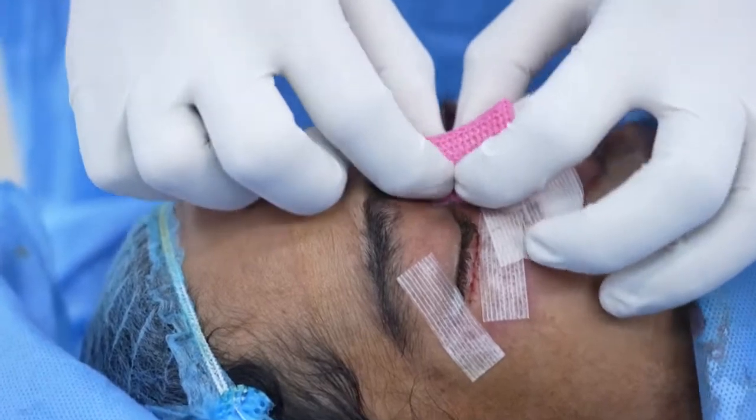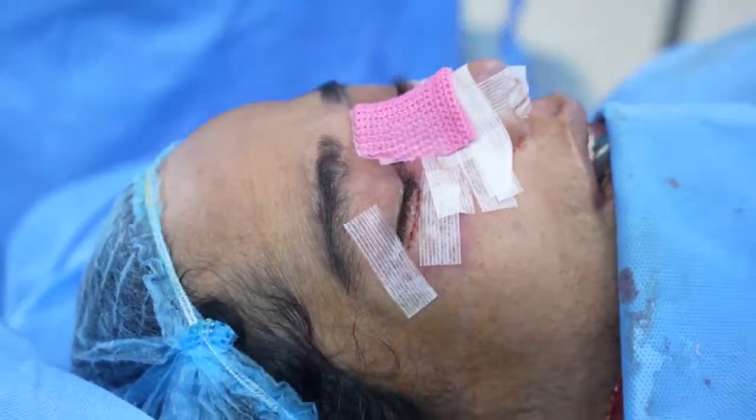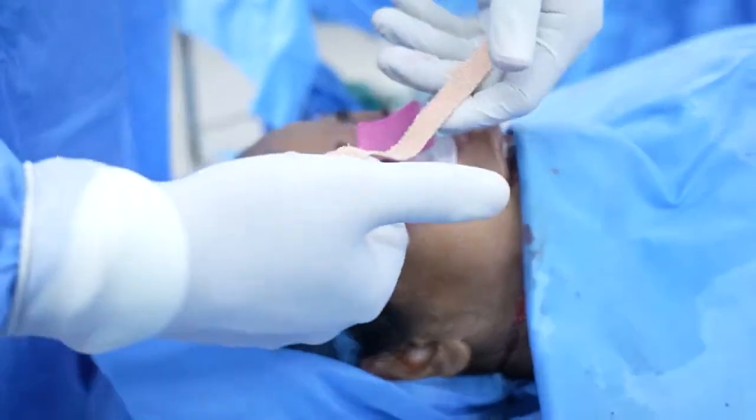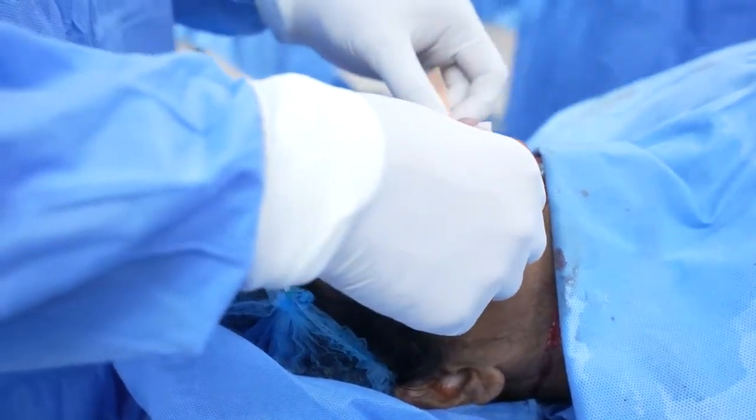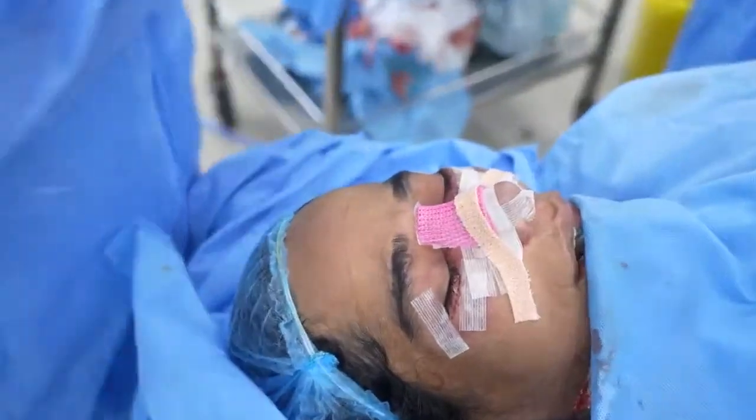Once we're done with this, the last step is to stabilize the splint. So we use Rhinoplast or elastoplast, and we can just tape it down. A couple of them usually.